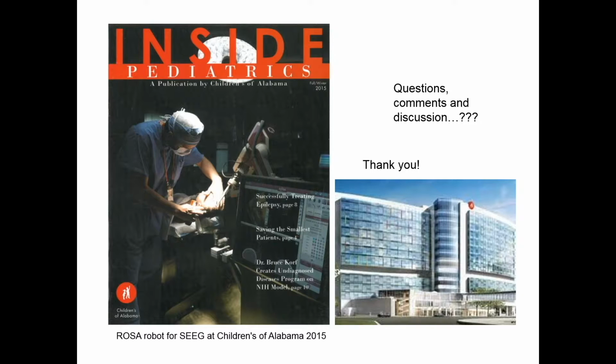I also take it into consideration in doing the planning a little bit, because you can come through adjacent areas of bone that are a little bit thicker. Fortunately, it really hasn't been a problem. If I were giving one single piece of advice to other pediatric neurosurgeons that are going to do this work in small children, it would be avoid tangential approaches through the thinnest part of the bone. If you have to come through the thin bone to get where you want with a safe trajectory, try and keep it orthogonal and use a short anchor bolt.